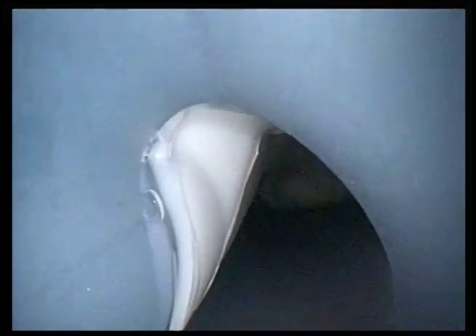The hallmark of the second generation supraglottic airways is the gastric drain. Here we examine an LMA protector that has bilateral gastric drains. First we examine the right-hand sided drain, the proximal end of which is similar to that found on the original ProSeal LMA. As we pass through the drain, we see the white material of the cuff of the LMA and eventually come to the distal outlet sitting above the esophagus, which is recognized by a dimple in the mucosa.